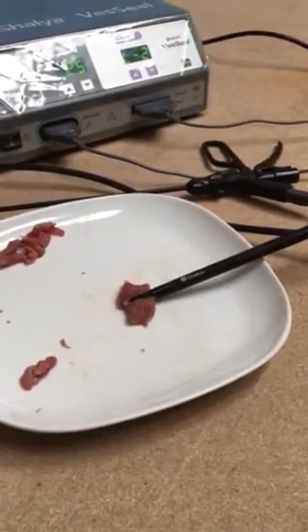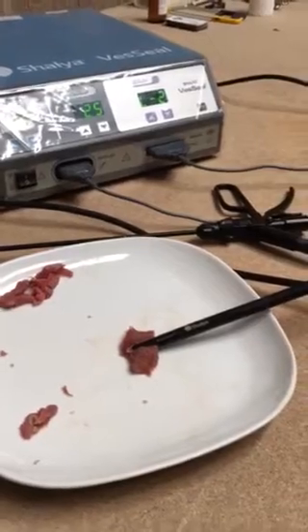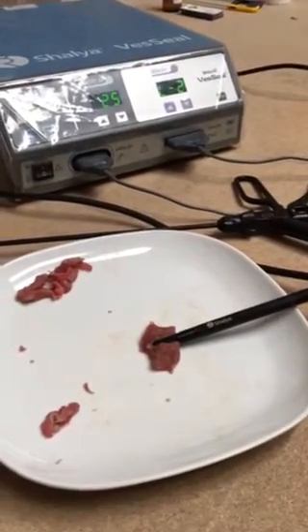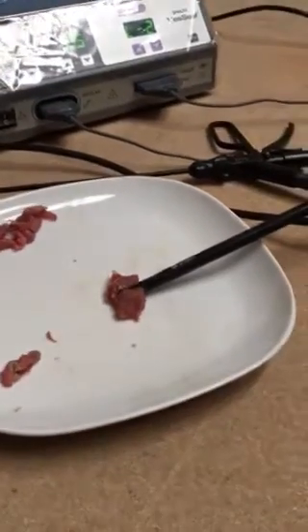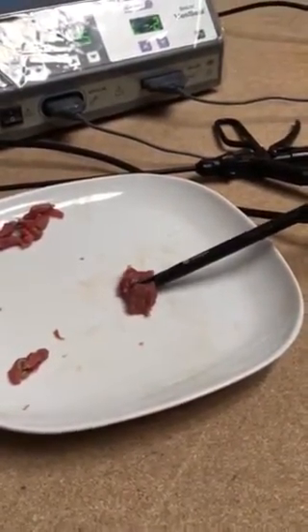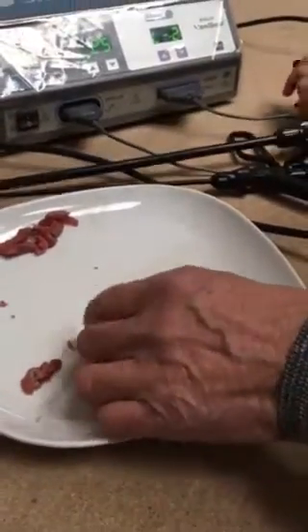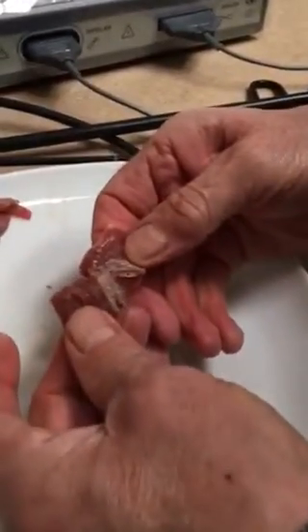We've now got a different alarm. I've still got my foot on the foot pedal, but the machine has cut out. So it's safe — you're not going to go through that. We now cut using the trigger, and then we can release and have a look. And as you can see, we've got a clean cut through the tissue.